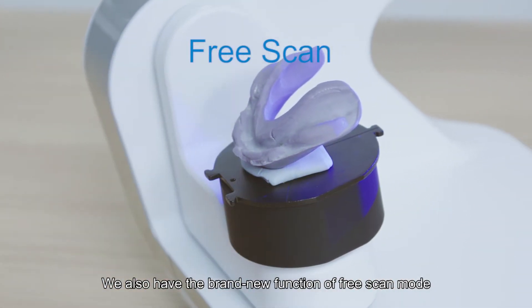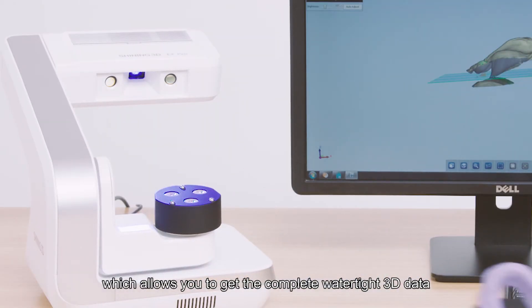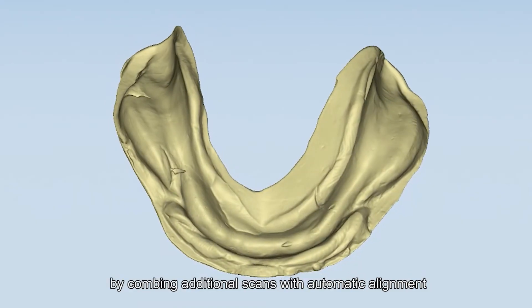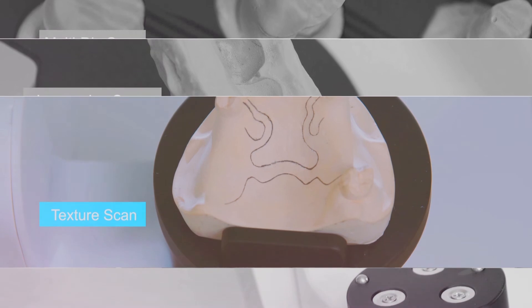We also have the brand new function of free scan mode, which allows you to get the complete watertight 3D data by combining additional scans with automatic alignment. Available scan modes include: articulator scan, body die scan, impression scan, texture scan, and free scan.